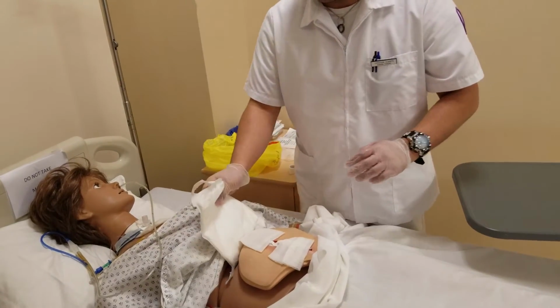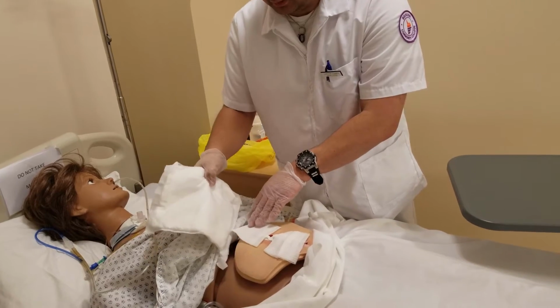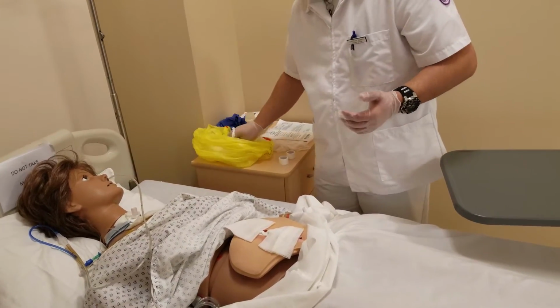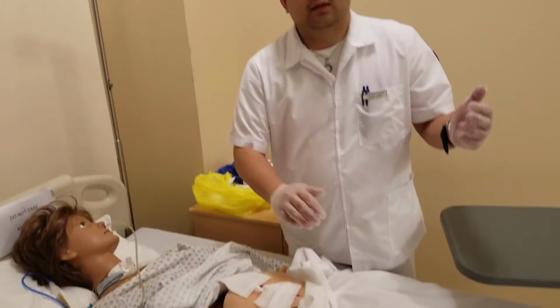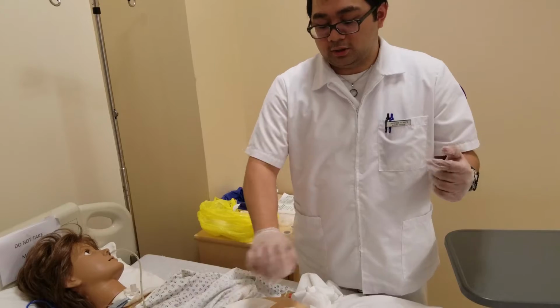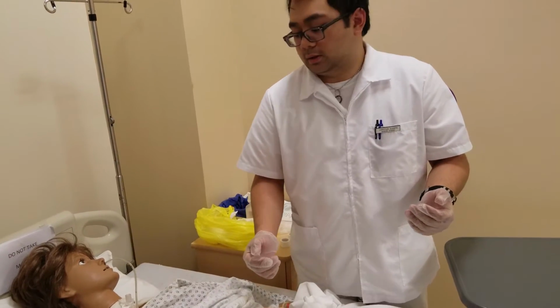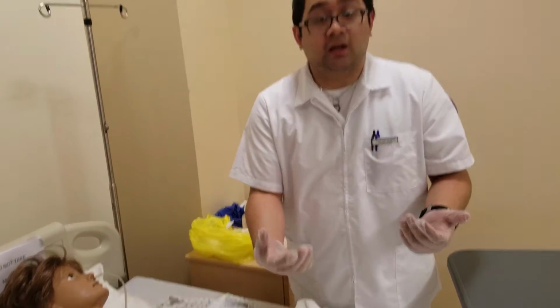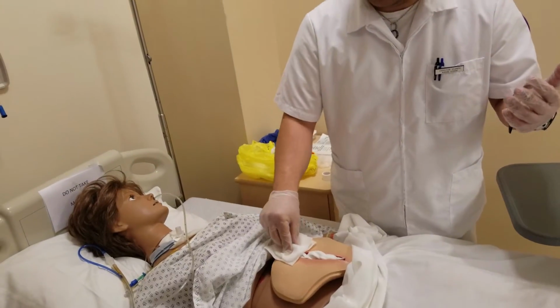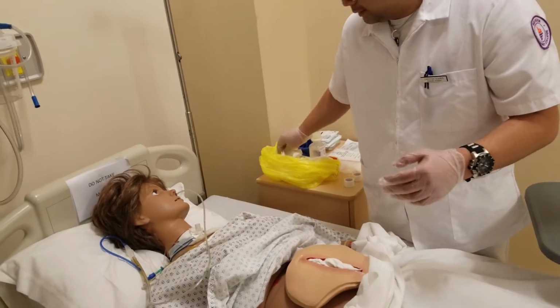just like so. The first layer is gonna be an ABD pad. So, this can go in the trash. Once again, we're constantly assessing if there's odor, color changes, how much drainage we're getting, if it's sanguineous, serosanguineous, and all that stuff. Looking at that.